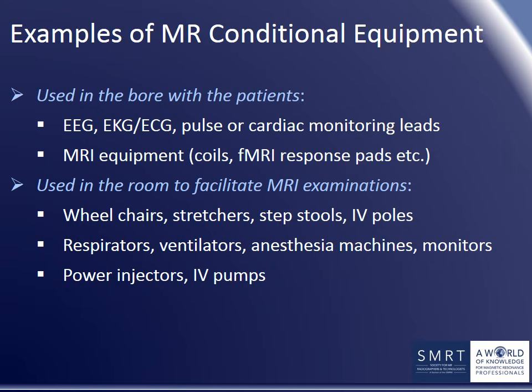Examples of equipment that must be deemed safe before use in any scanner room include items such as wheelchairs, stretchers, ventilators, IV pumps, power injectors, and other accessory items, to name just a few.